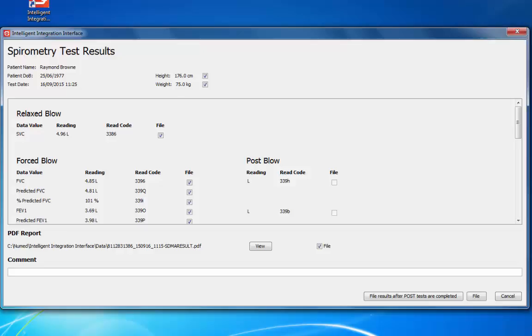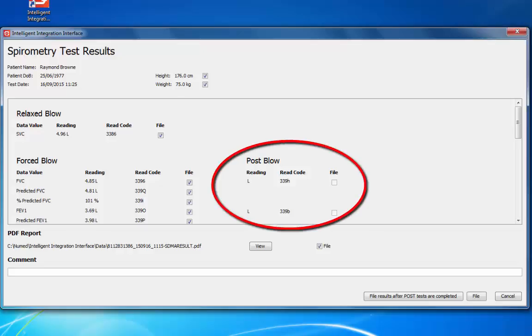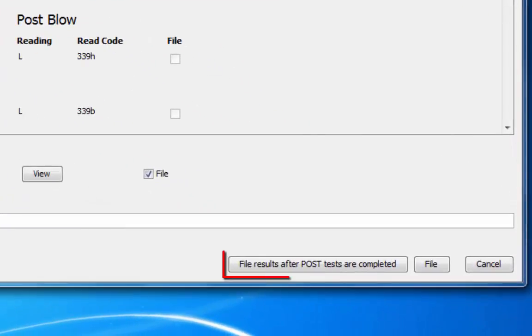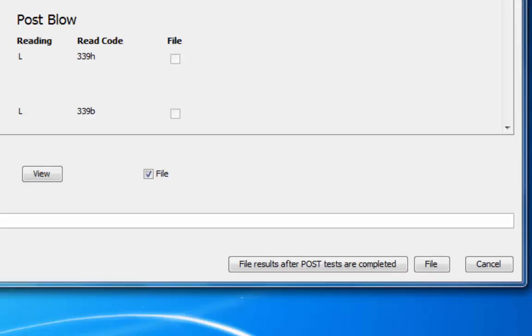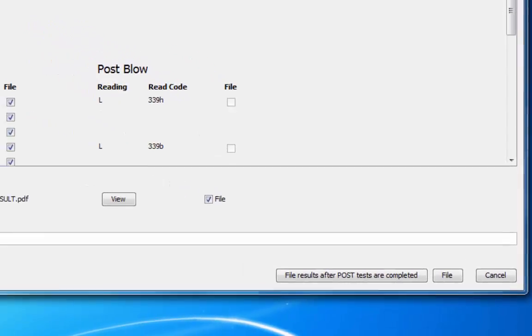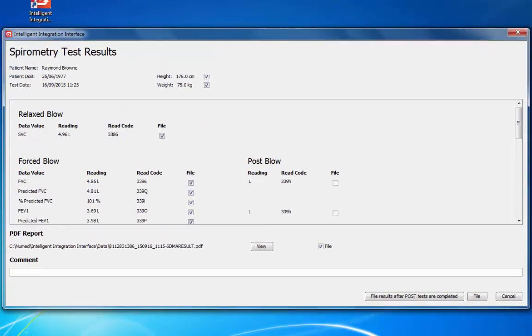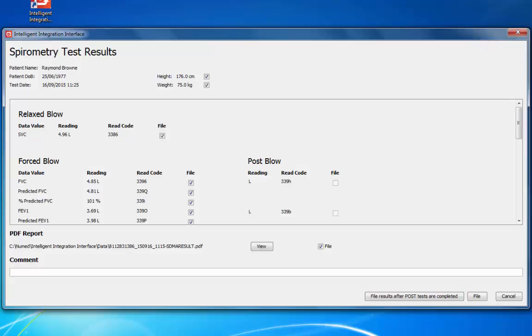If no post-bronchodilator values are detected, there will be two filing options available: 'File results after post tests are completed' or 'File'. If post-bronchodilator tests will be completed within the next hour, click 'File results after post tests are completed' — this will allow all values to be filed in a single entry after the post tests are done. If you are not performing post-bronchodilator tests or they have already been completed, click the File button. For now, we will choose 'File results after post tests are completed' to simulate the patient leaving the room whilst the bronchodilator drugs take effect.